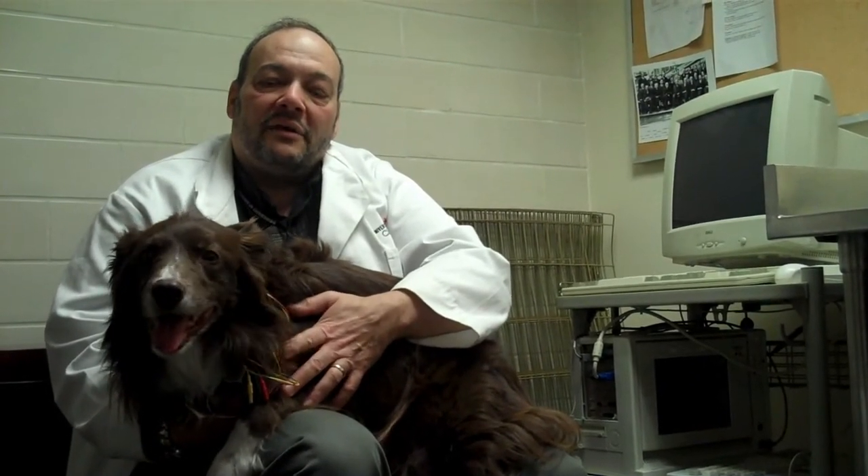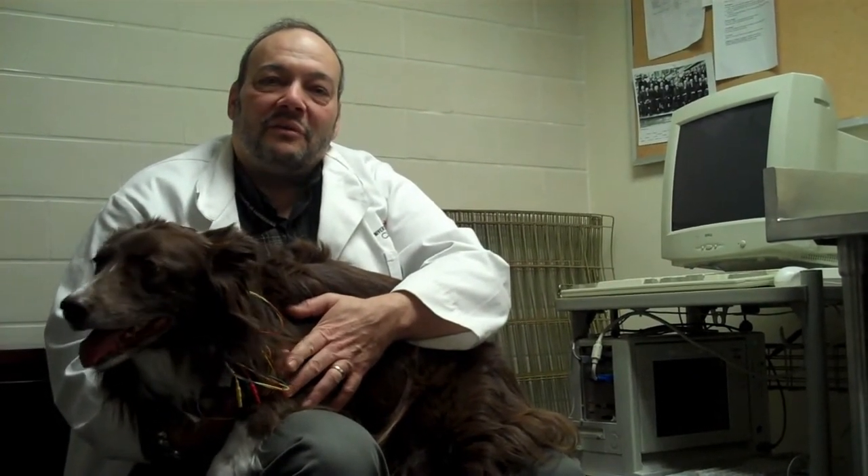Then the vet will come in and do an otoscopic exam of her ears, and we'll do a quick physical exam, and then we'll be ready to go for the testing. She'll go into the sound booth, we'll put the electrodes on her, get an EEG, and the testing will begin.